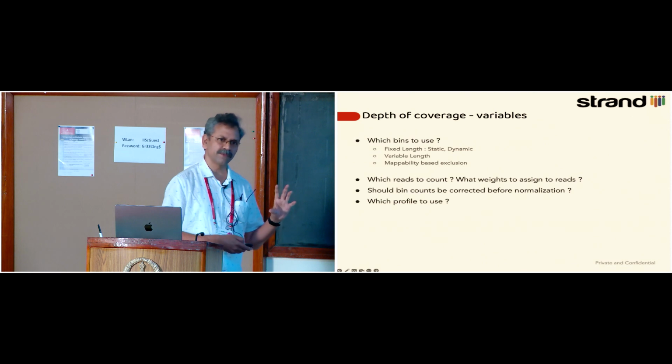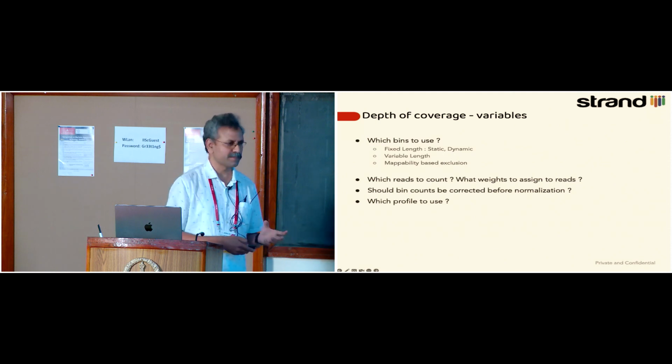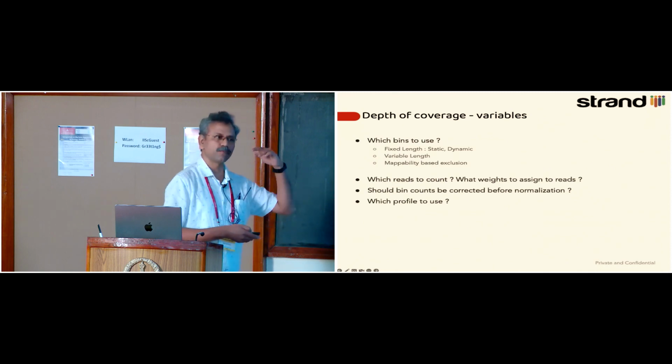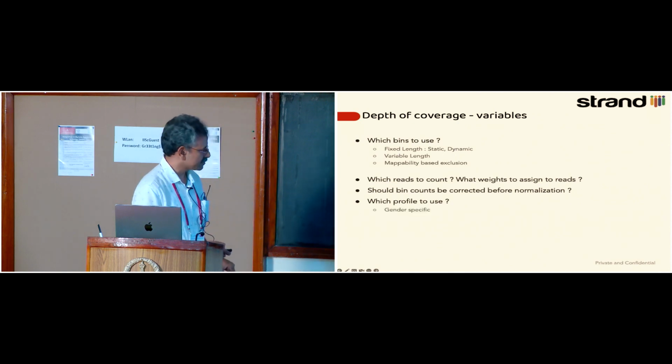The blood samples behave in a certain way. Cheek swab samples, for whatever reason in the laboratory, they introduce a different type of signal. They behave slightly differently. Amniotic fluid samples behave slightly differently. Every batch of samples that we sequence on the sequencer, for whatever reason, will have a slightly different normalized count profile. How many different things should we take into account to compare one sample against a profile? What is this profile? That becomes the next thing.